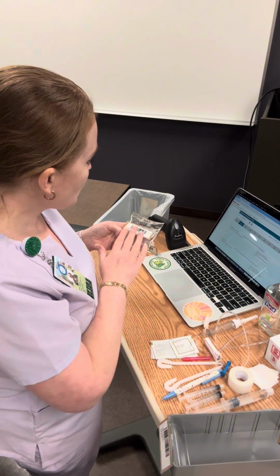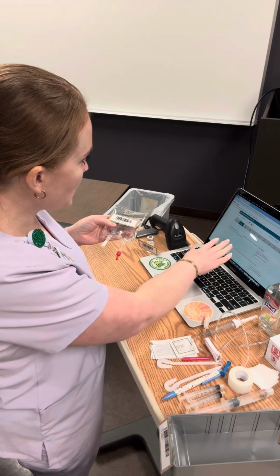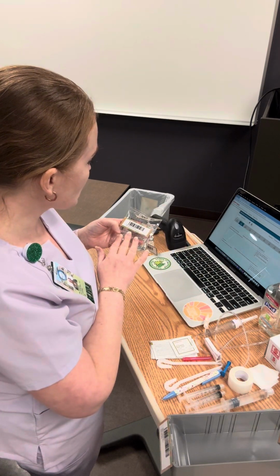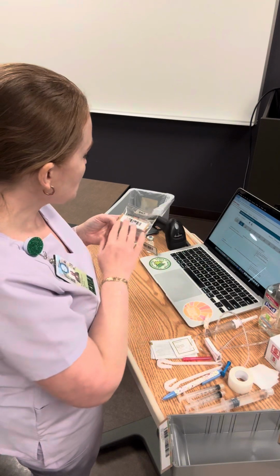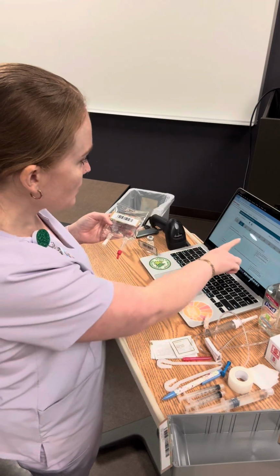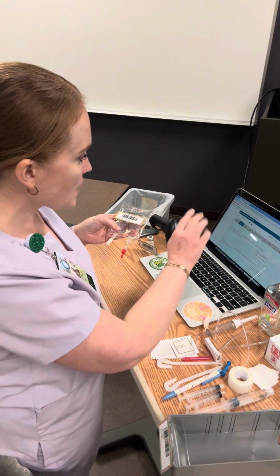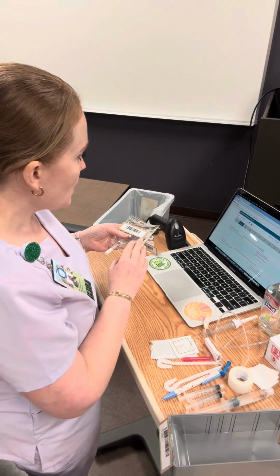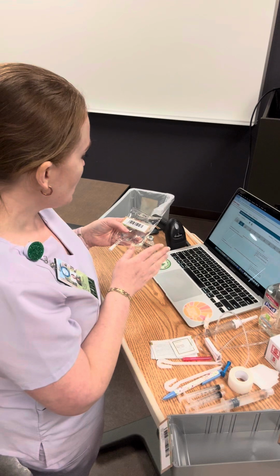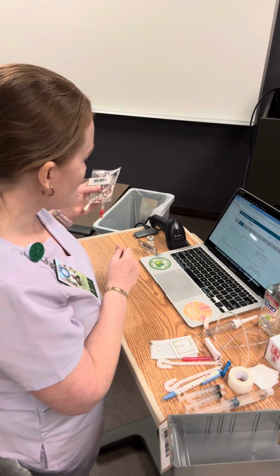Scroll down, I have the right drug, meropenem. The right route is going to be injectable infusion, IV. The right dose is going to be 500 milligrams. The right time is going to be 7:14. It is 7:14. And then we are good to go with MedCheck 2.